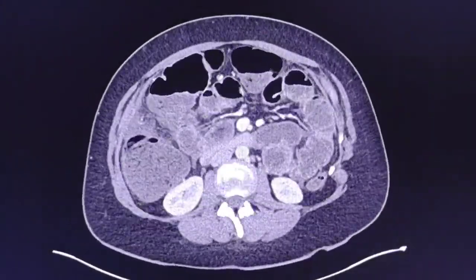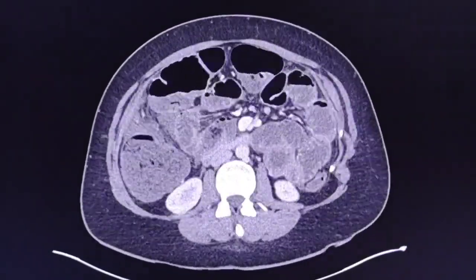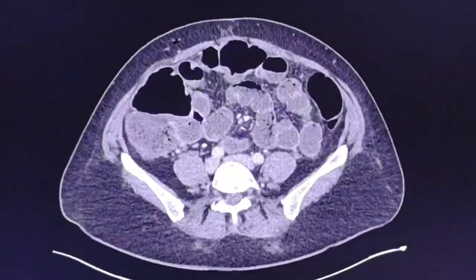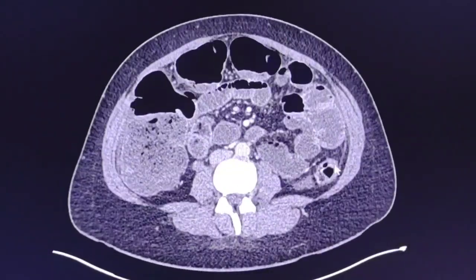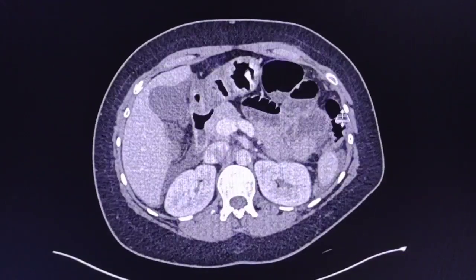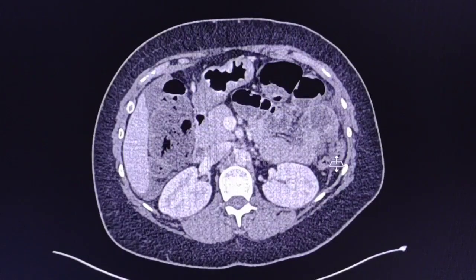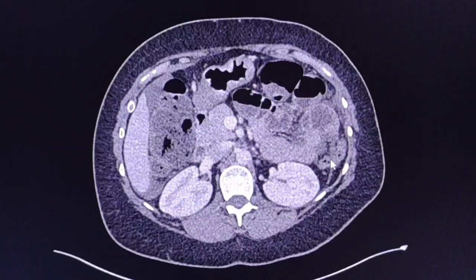This is typical Ogilvie syndrome — pseudo-obstruction. It is not real mechanical obstruction. There is no true stenotic point or mechanical obstruction; it is a kind of ileus. This is Ogilvie syndrome, and this is the most common cause of bowel dilatation after caesarean section.